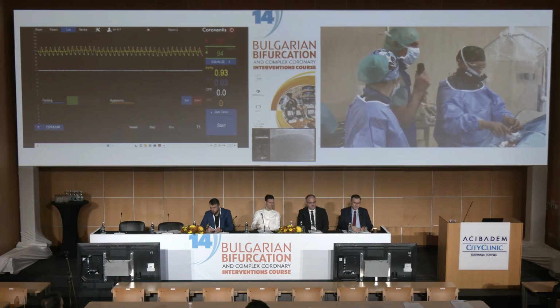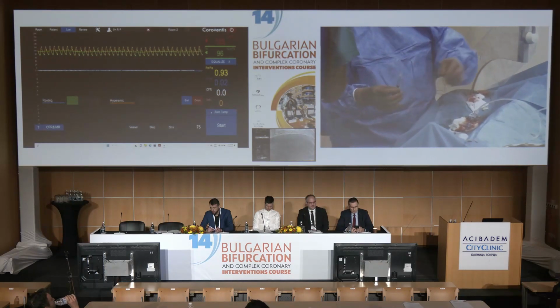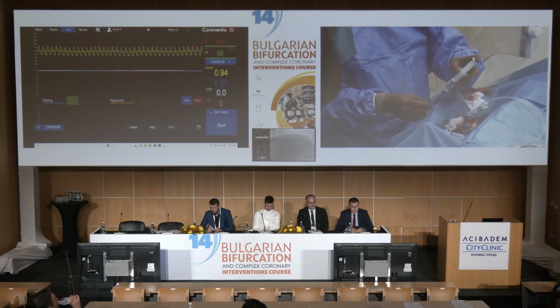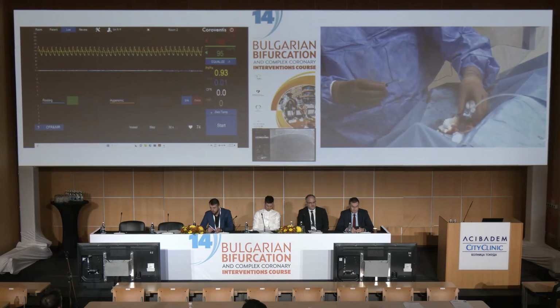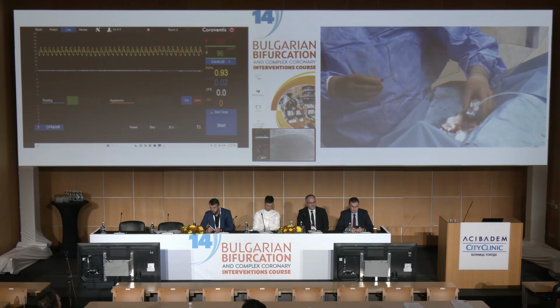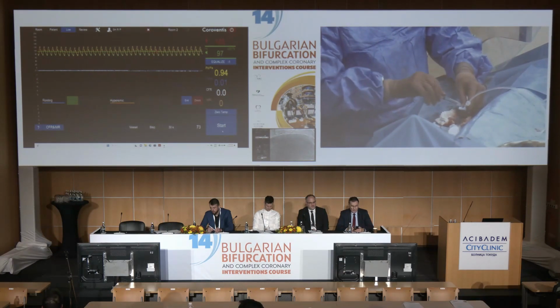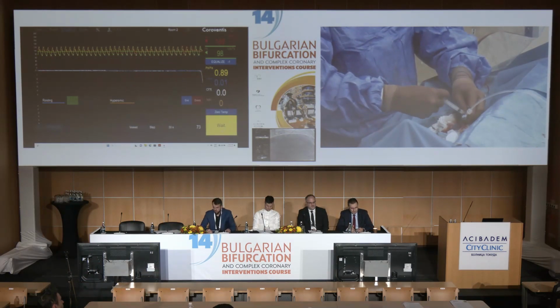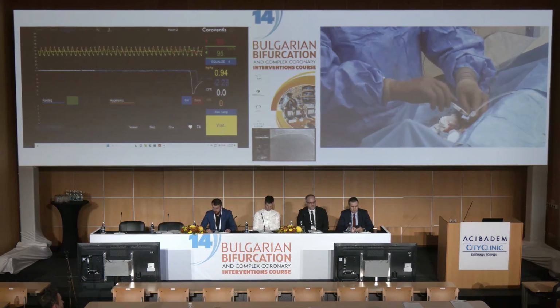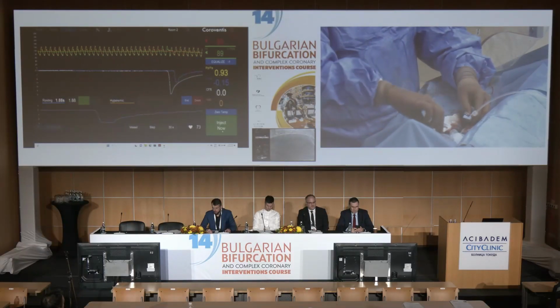We have to zero the temperature, so Tabo is going to do that. Yeah, okay. Temperature is 0, and when you are ready, you just tell us what you are doing. Okay, ready? We should start the program. Yes. And it is very intuitive, and it leads you through. Okay. We're making 3 milliliters of saline. You don't have to do that.